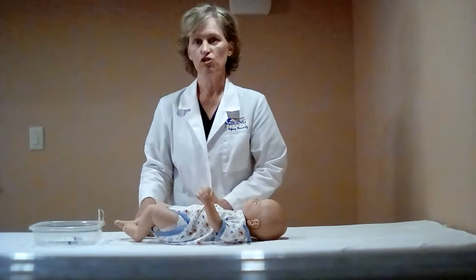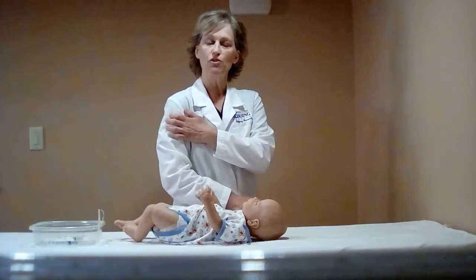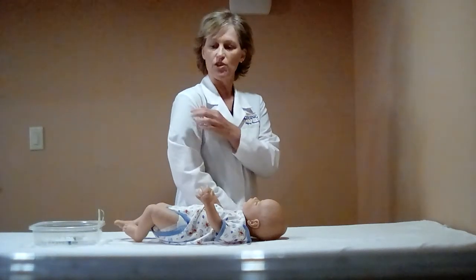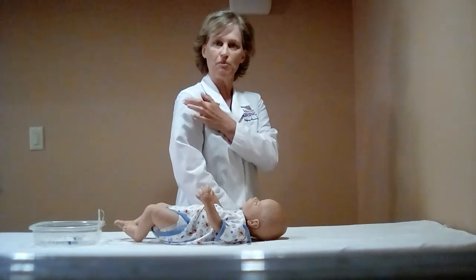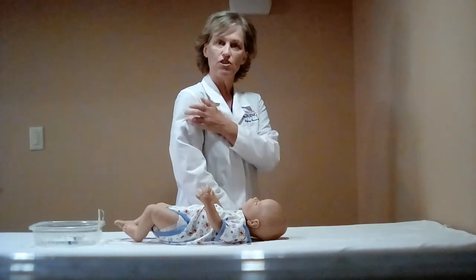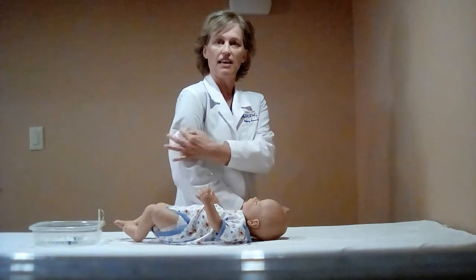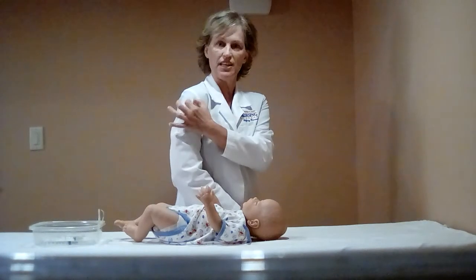To give an immunization to an older child, you would use the deltoid muscle for IM and the back of the upper arm for sub-Q injection. To find the site for the deltoid muscle, you would put a finger on the lateral area of the acromion process and place 3 fingers down. This is where you would give the injection, at your lower finger, making sure that it is above the axillary line. The axillary line forms the base of the triangle for your site.